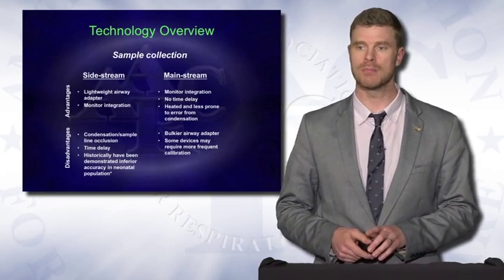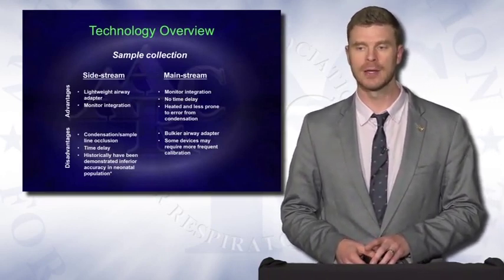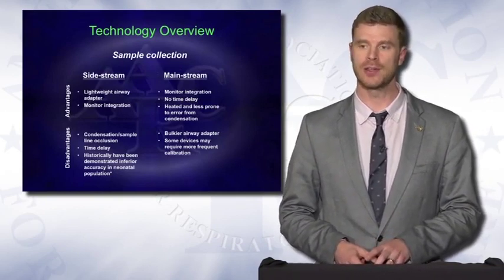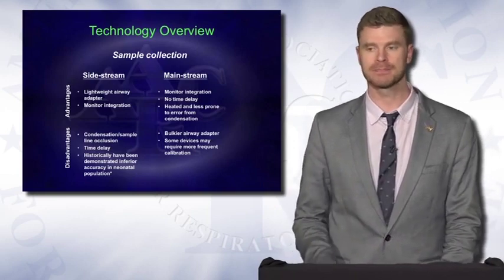Disadvantages, I think, of the mainstream CO2 monitoring device. Number one, it's a bulkier airway adapter, making it more heavy and perhaps less applicable in small neonates. And number two, some of these devices may require more frequent calibration.